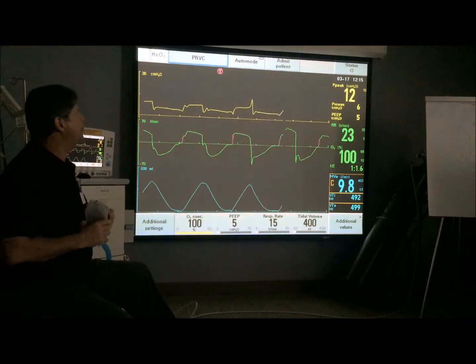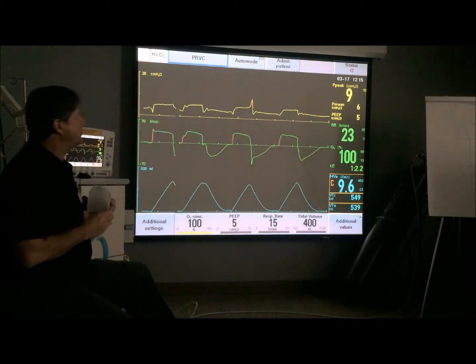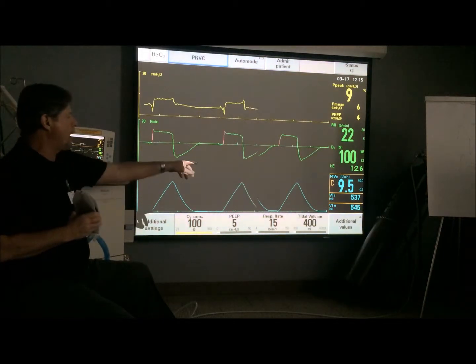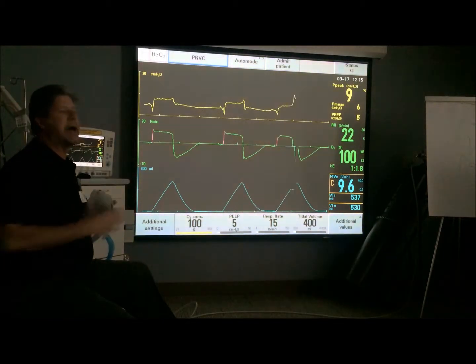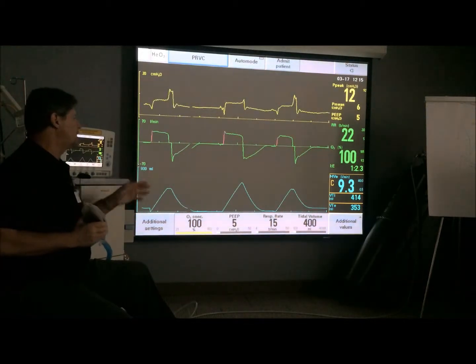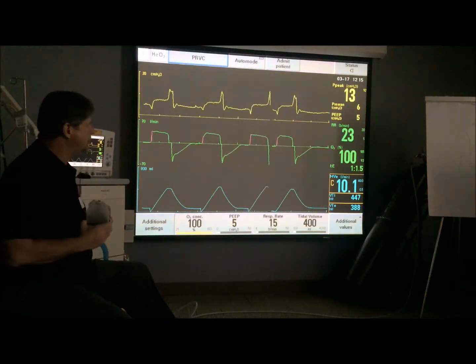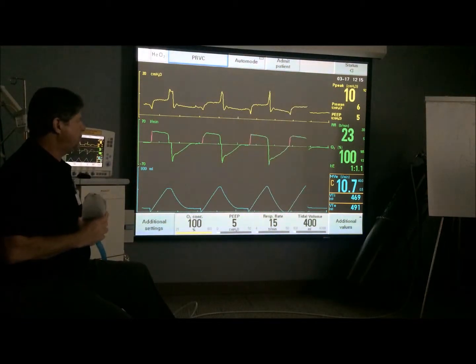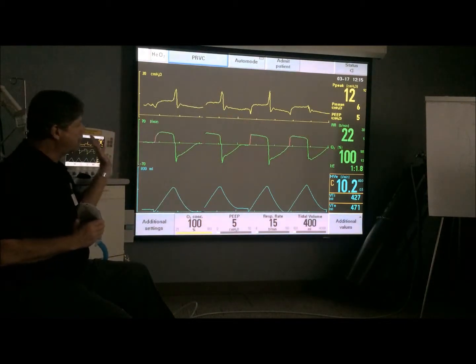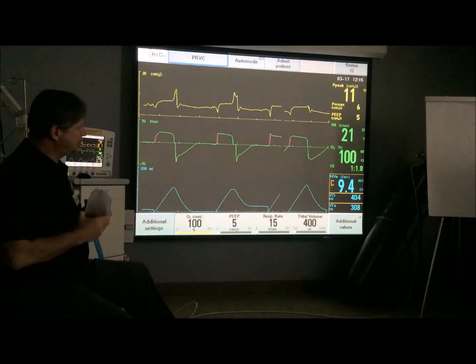It's lowering my pressure. And as a result, if I have a lower pressure, the ventilator doesn't have to deliver as much flow to get to that lower pressure point. And as a result, I'm being flow starved. So when you're using a low tidal volume strategy, or you have a patient that's interacting significantly with the machine, you'll find people say, oh, PRVC doesn't work on some of my patients. And it's because they're struggling, because they've pulled the pressure down, and the ventilator is doing what it can.